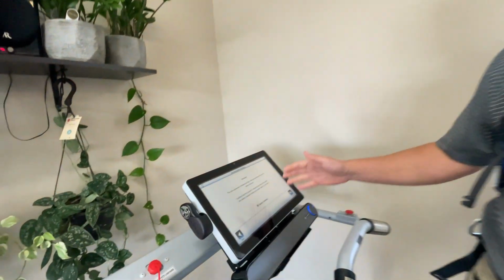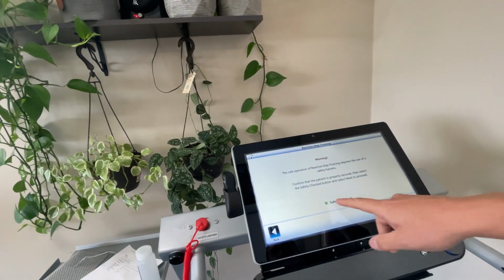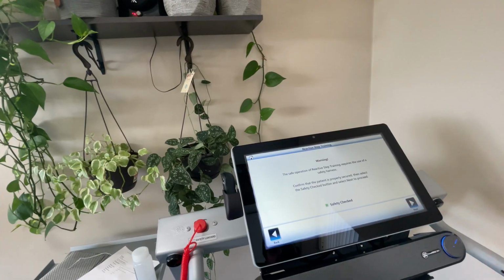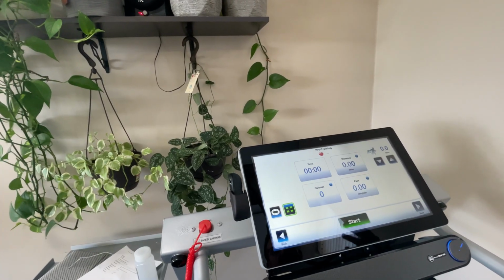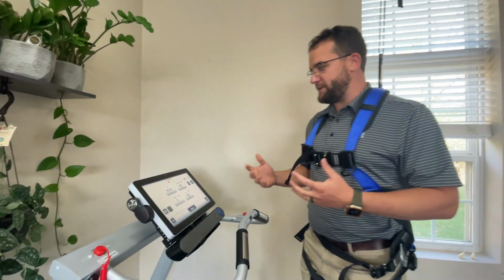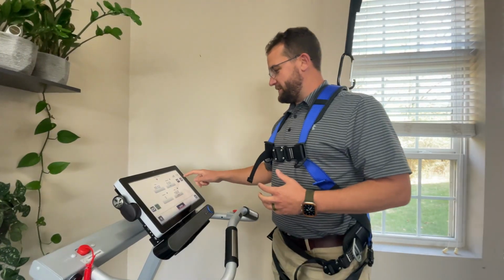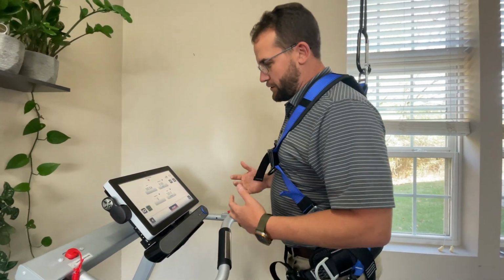As we first come in here, we always make sure that the screen asks, are the individuals safety checked? We always have to hit yes, they're safety checked before we can move forwards. What we then move into is a practice trial or pre-training. This allows the therapist to make sure that the patient feels comfortable walking with the harness on, that they feel secure on the treadmill.